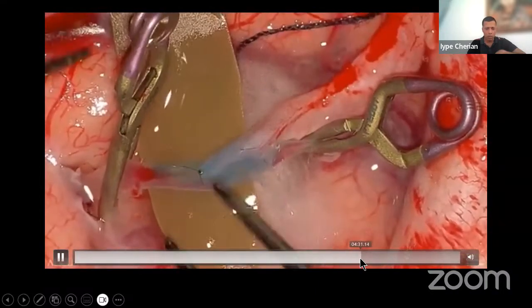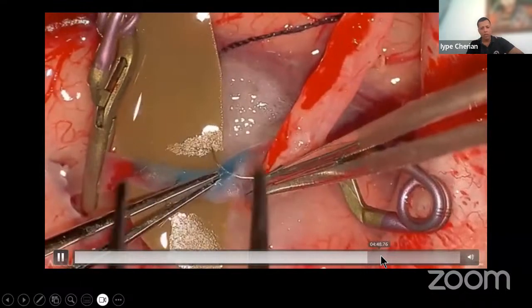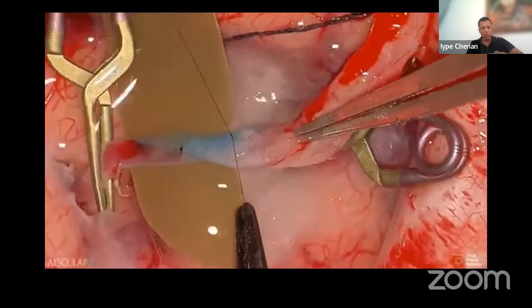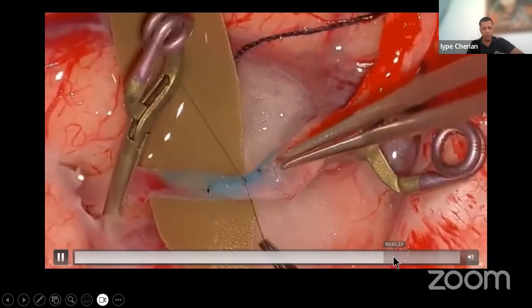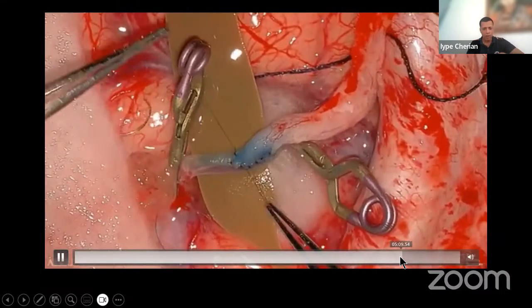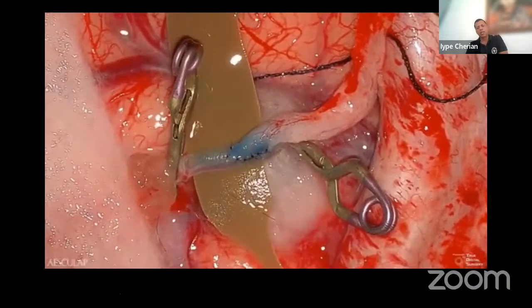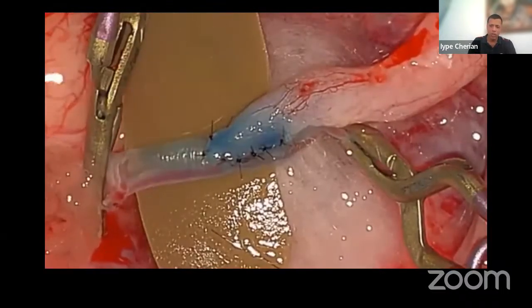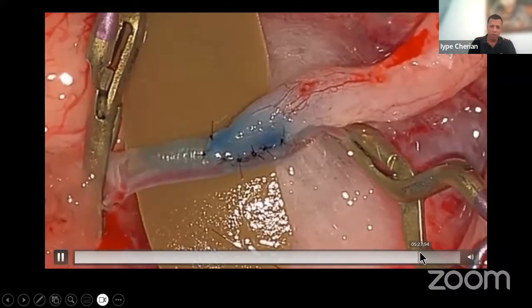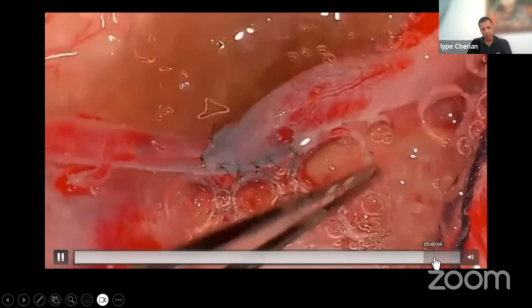Again, the zoom is near 40. 12 sutures: 5 on each side, plus toe and heel sutures. So 12 sutures in total, no leak at all. The anastomosis is complete. These anastomosis instruments are designed by us. They're from a company called Omedic, and it's Indian instruments, very cheap actually. The entire set is available for maybe $400 with 8 instruments, compared to the very costly anastomosis set we used before.